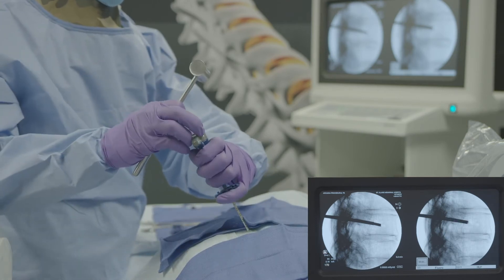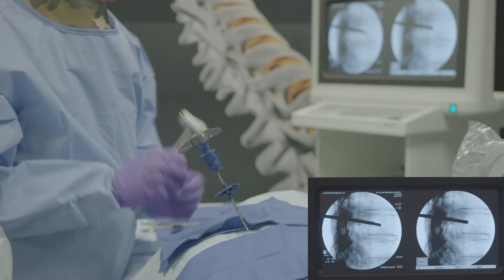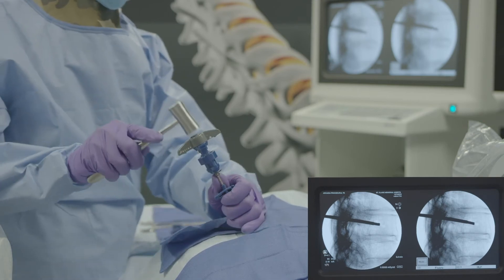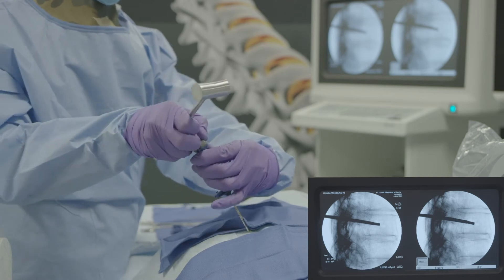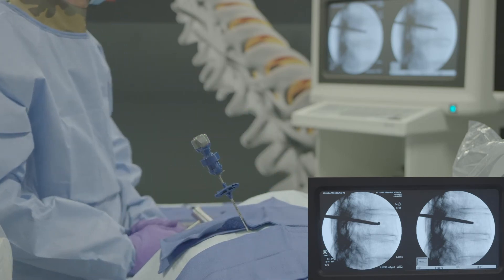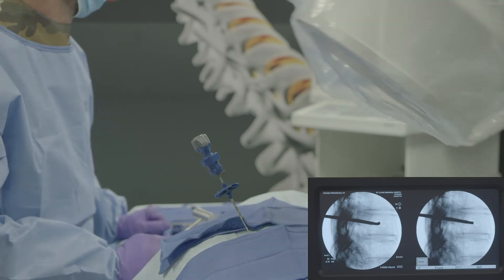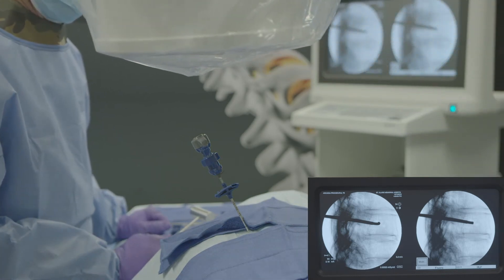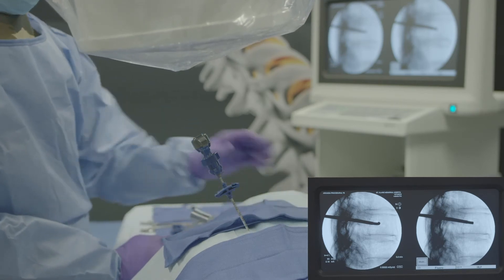Alternate advancing and tip deployment with AP and lateral imaging. Verify in the AP view that the distal tip of the power curve navigating osteotome is across midline, at least to the medial border of the contralateral pedicle.